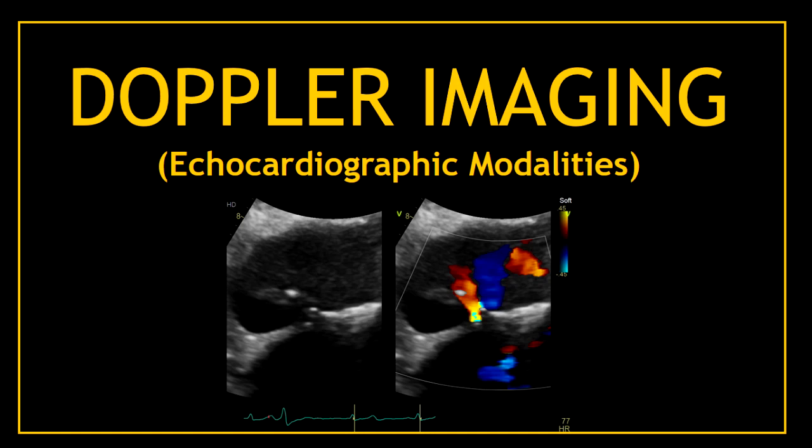This is the second video about echocardiographic modalities and I'm going to talk about the Doppler imaging.